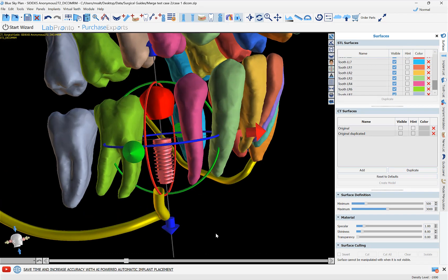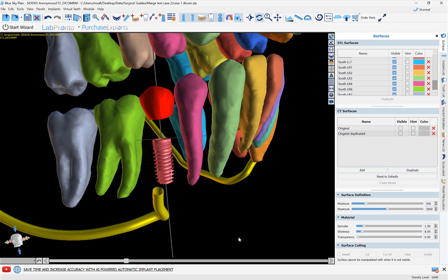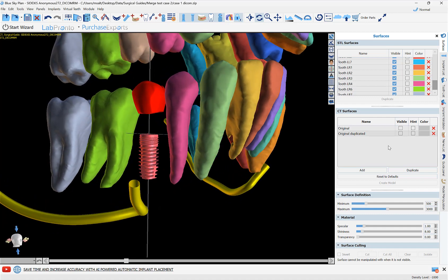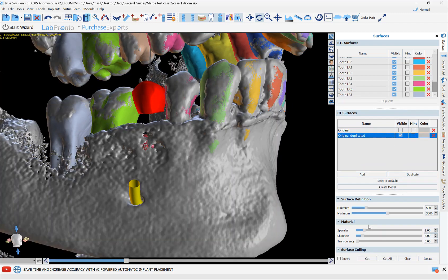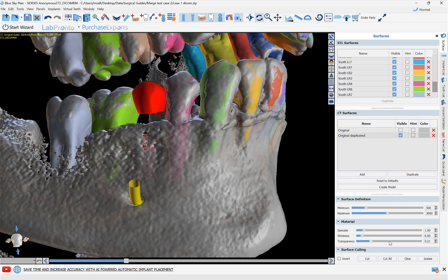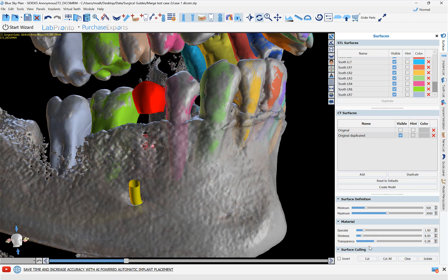Now we can see our implant and crown placed in relation to the automatically CT tooth-segmented teeth. For added information, we can toggle on our bone visibility as well, and use the transparency slider to see through and check the proper positioning.